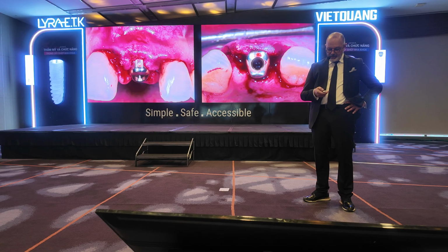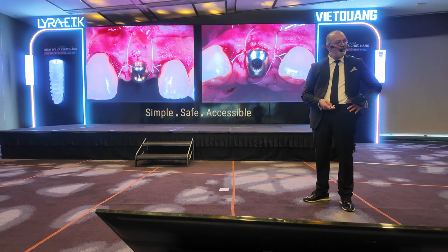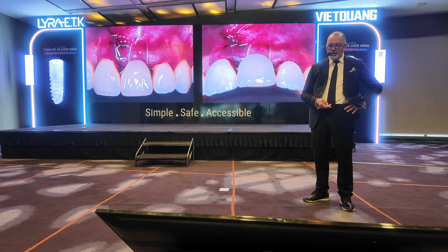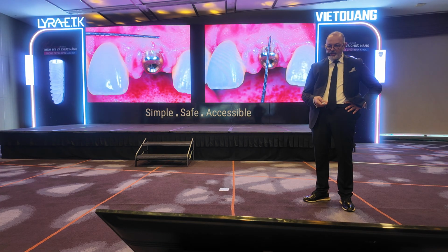So when we place that and we design the two future papillae here, we suture with the same technique in order to have a real sealing of the suture, and we reline our provisional, being out of any conflict with the healing.